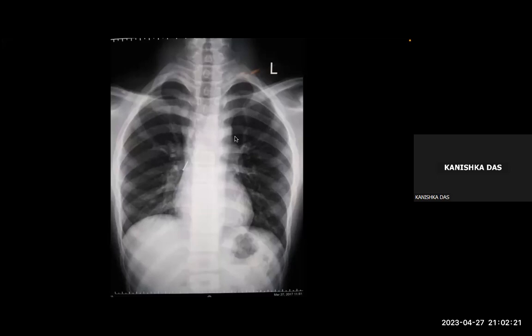So it is pointed. It is a sharp foreign body. So holding it will be difficult. Correct. Because the head is pointing that side, holding it will be difficult. What instrument amongst what you have are you going to try to take out this metallic foreign body with?